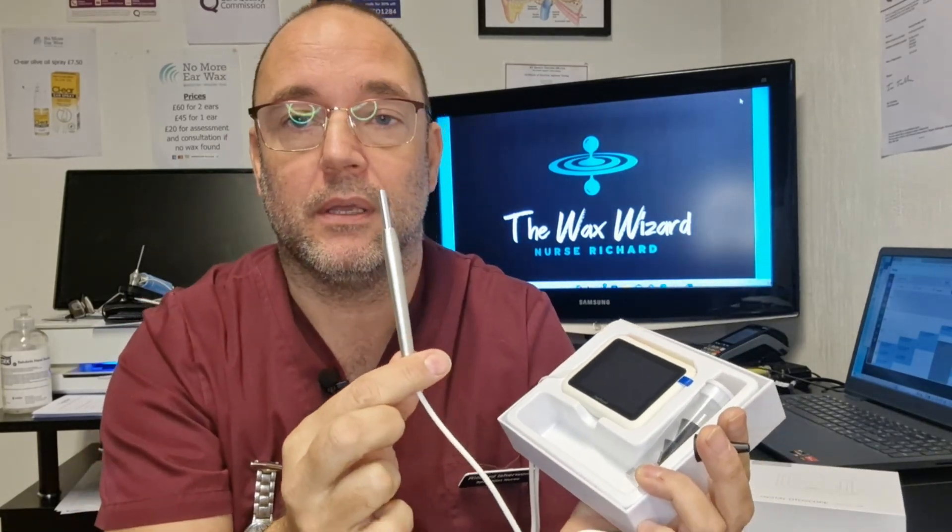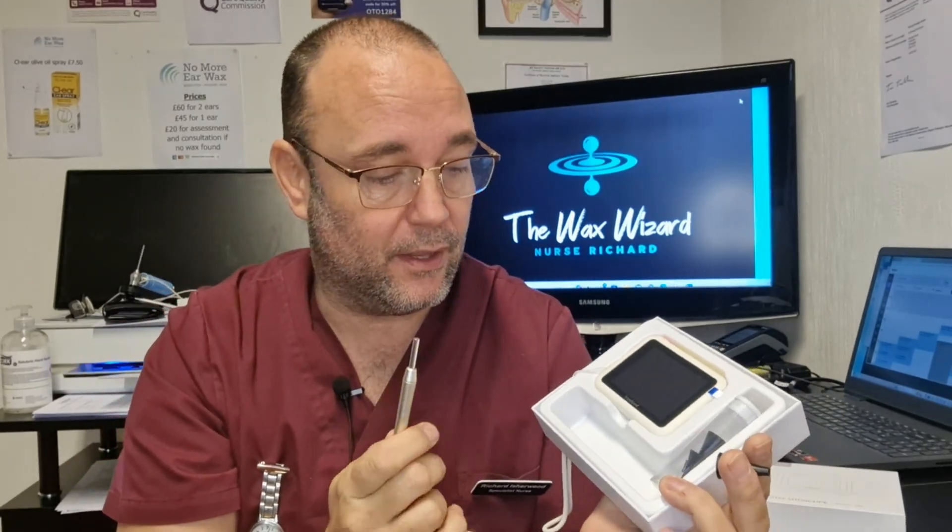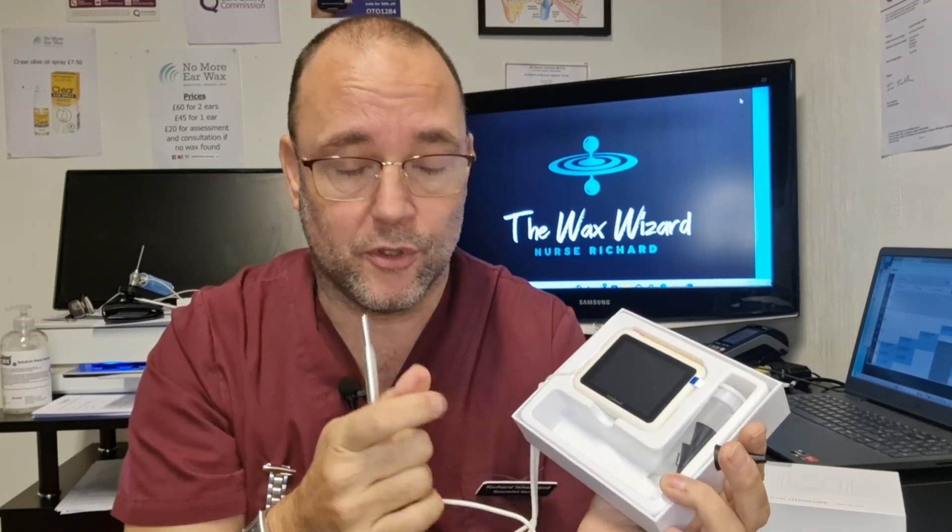So let's open it up and have a look inside. This is what it looks like when you open up the Scope Around. What do you get inside it? You get this camera here, and it's literally just plug and play. What I think sets this apart is it comes with its own monitor, so you can literally just plug the camera into that monitor and away you go.